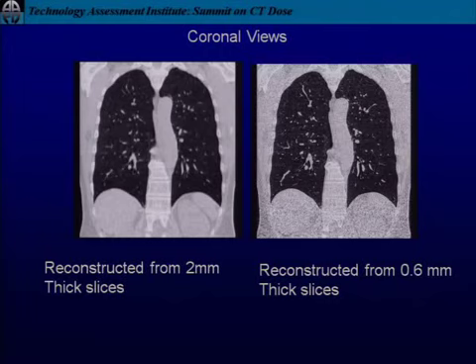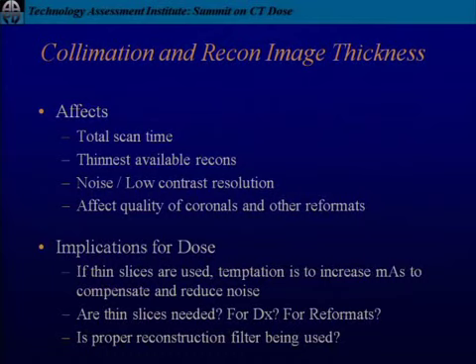We're not looking in the abdomen, but if you were, here's what happened. We gave up that nice, even small separation in tissues there, and we've just obliterated it with noise. Okay? So there's a classic example of the slice thickness versus noise, and it shows up even in the coronal reformats. Okay. I think this is near the end for me.